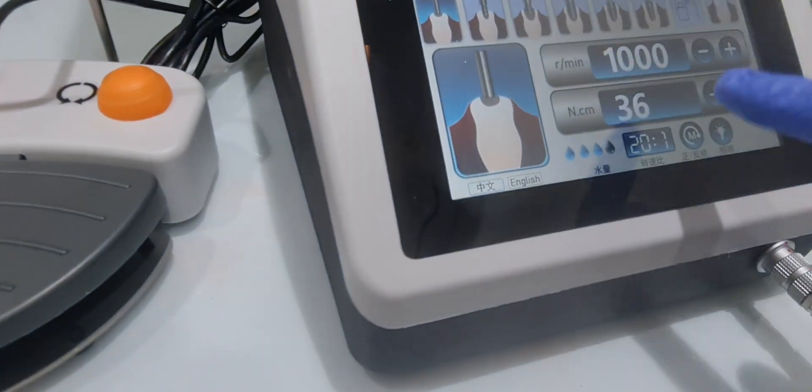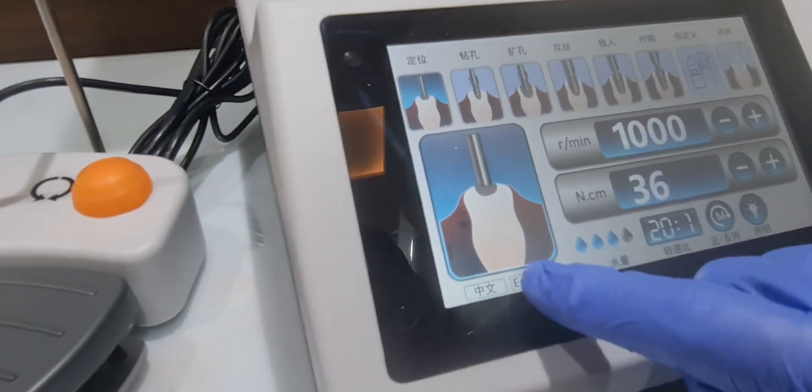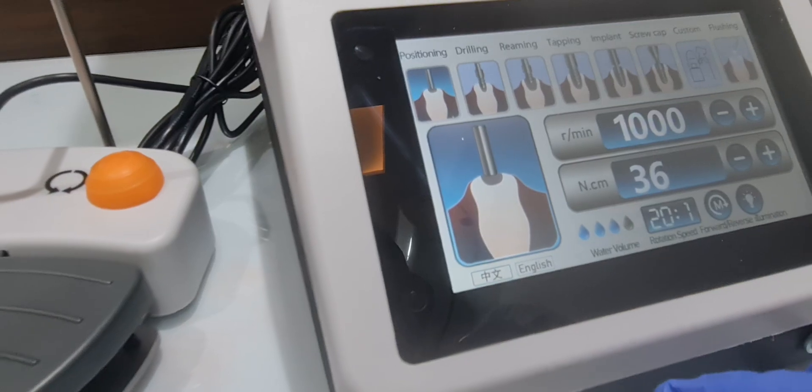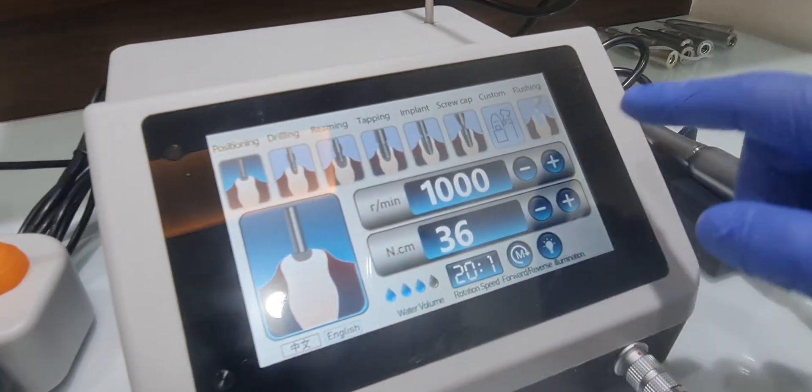There is a language setting. You can press English, so it converts to English.